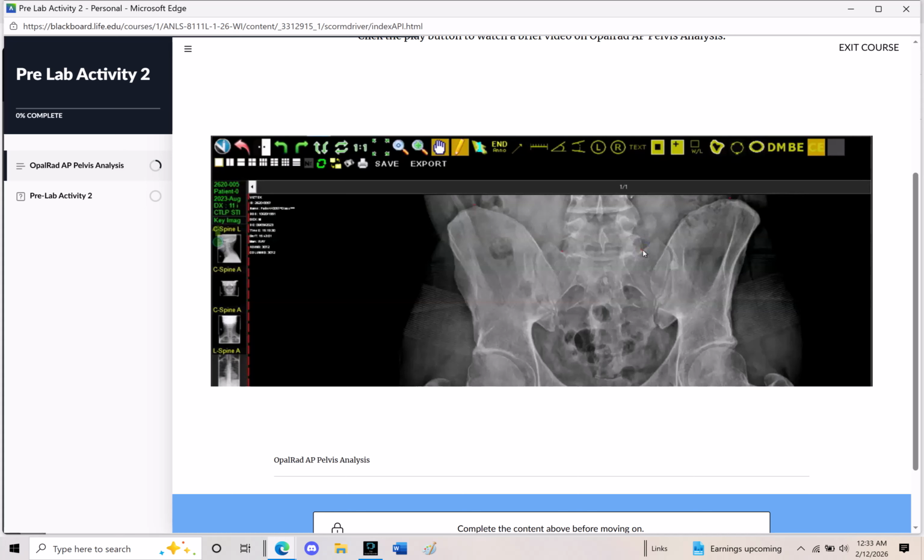And then back to 5, S2, that's the center. And then 6, we're going to start all the way over the very bottom aspect. Left ilium, edge. And then 7, the lateral aspect of the sacral area, the most lateral.